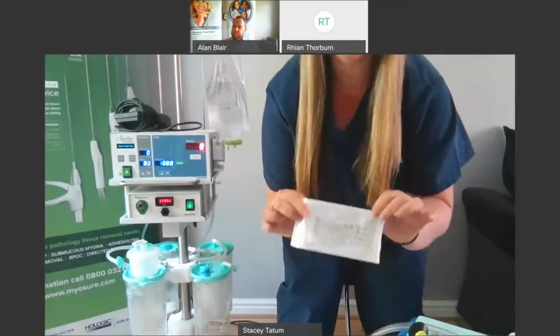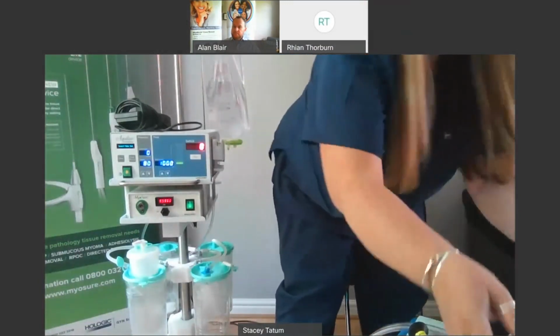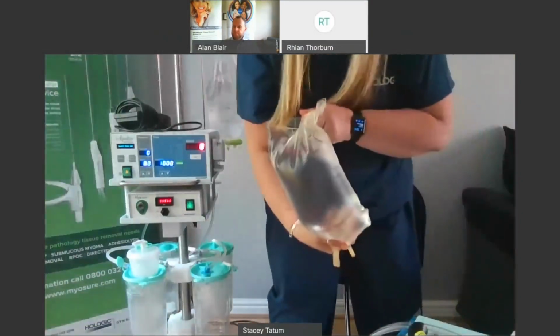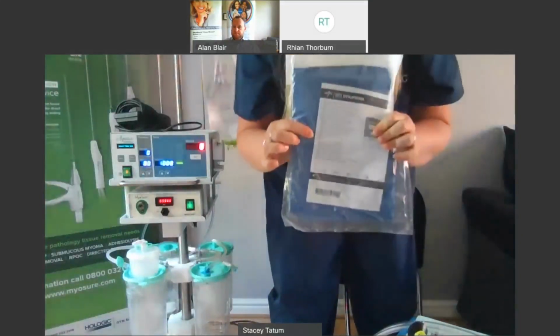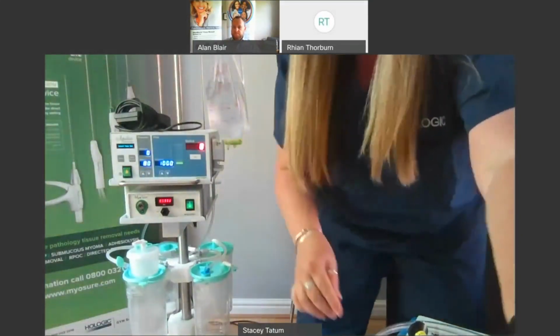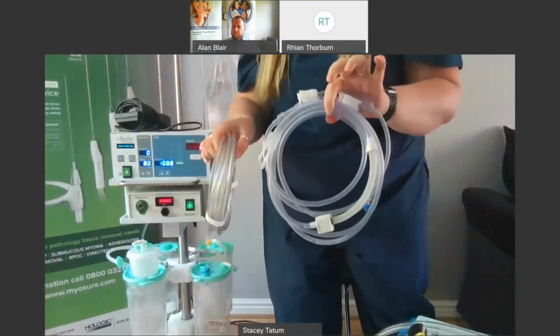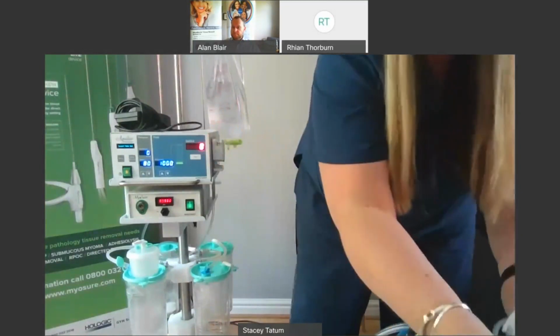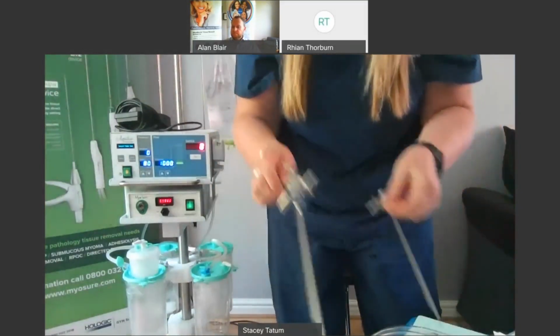You'll need MyoSure tissue removal devices, MyoSure bungs, a 3-litre bag of normal saline, an under buttock drape, preferably with a tap on it, and some inflow and outflow tubing, MyoSure inflow and outflow tubing. I'll explain those in a second, and of course, a MyoSure scope.